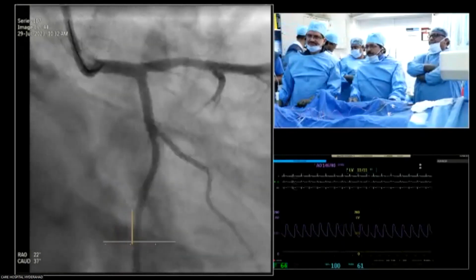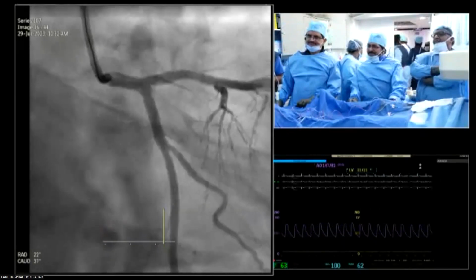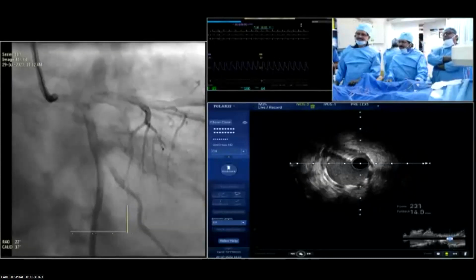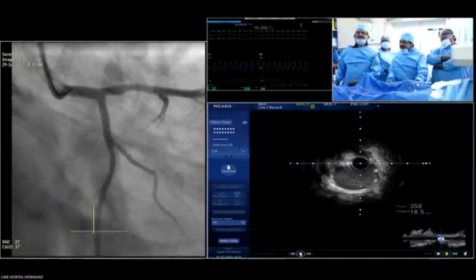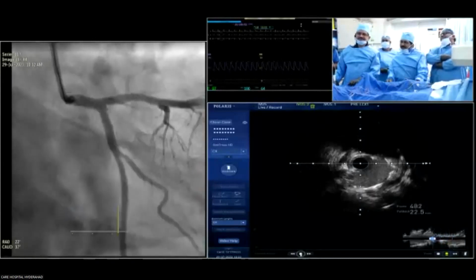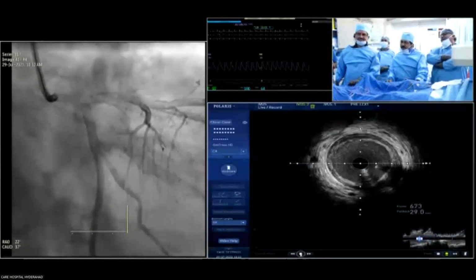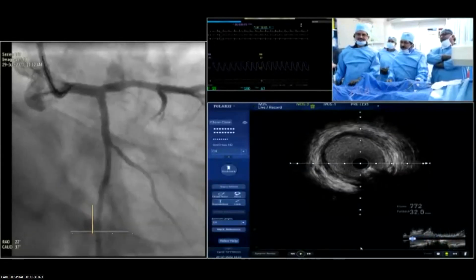I think that's really what we've all admitted to ourselves now, that the benefit of intravascular imaging is just what we've demonstrated here, where you think you've got the ostium of the circ, but in fact the stent comes back, and so you optimize it to get the very best result you can. This is a lovely, very well expanded stent throughout this segment. There was that little area that it looks like you've now further dilated. Yes, dilated with the 3.0 balloon, and after that the IVUS was also done, which has been on display.